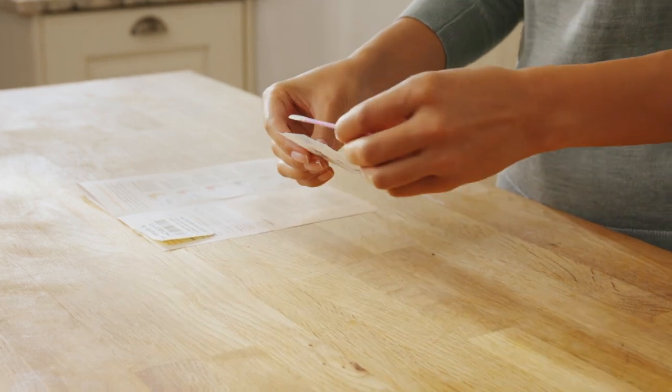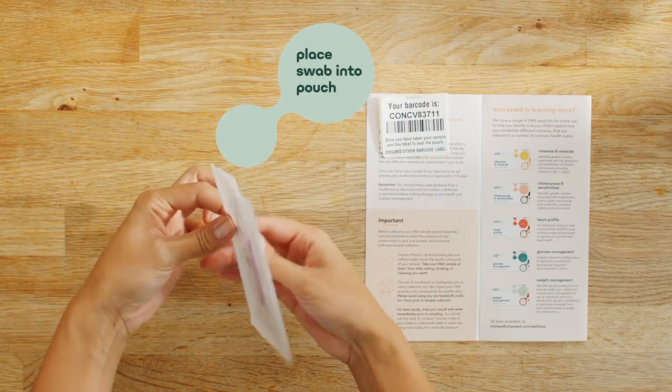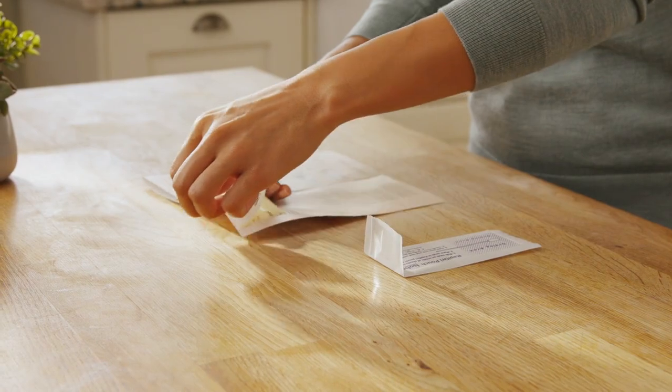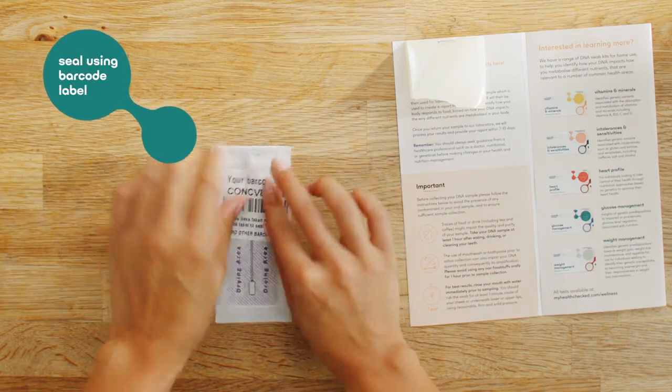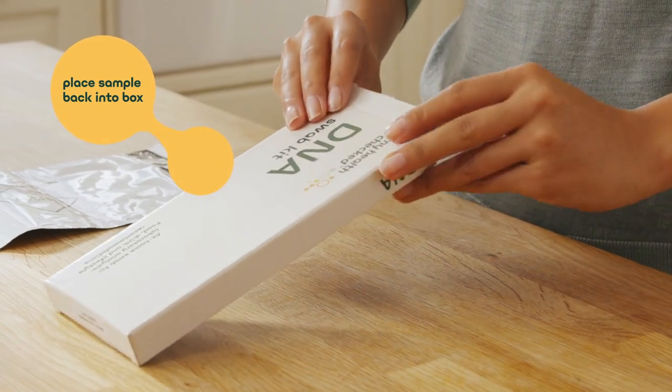Carefully place the swab back into the inner rapid-dry pouch, ensuring the head sits within the drying area. Secure the pouch at the fold line and use your unique barcode label to seal it. This is very important so we can identify your sample at the lab. Put the pouch back inside the original box.